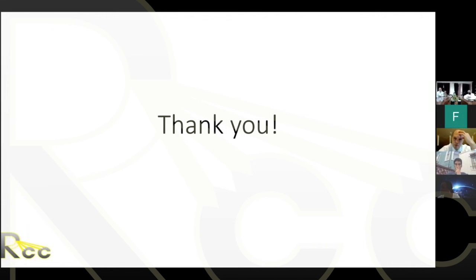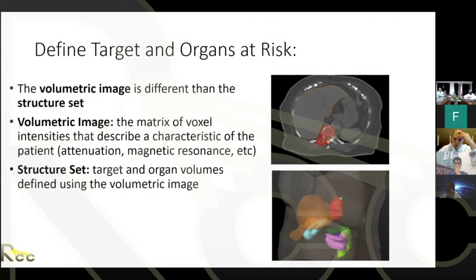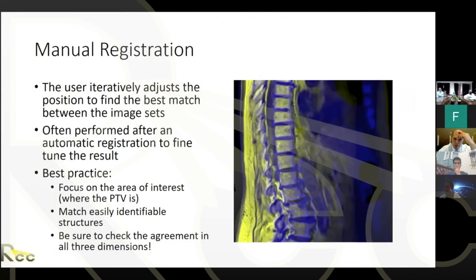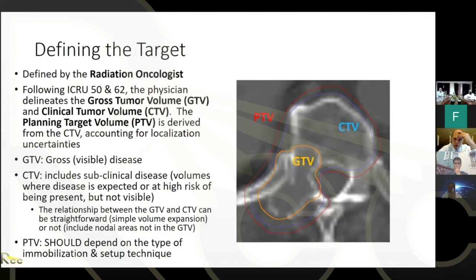This was great. Is there a difference between CTV and GTV and what? Sorry? Density. Yes. So, you want me to answer? Yeah. Okay. So GTV is your gross tumor volume, right? It's what the physician can see or feel.